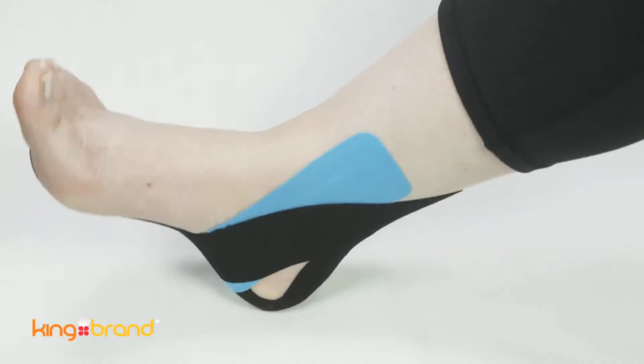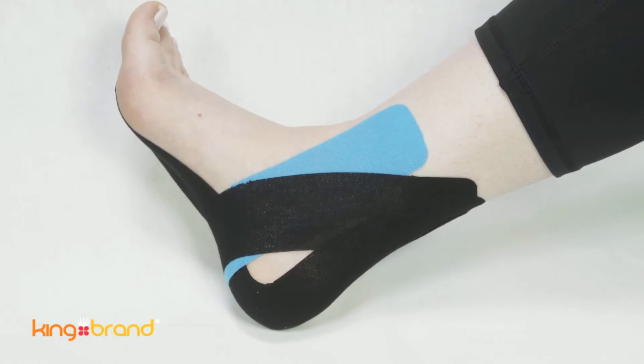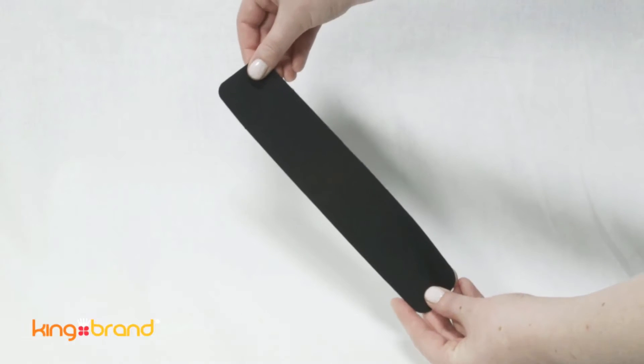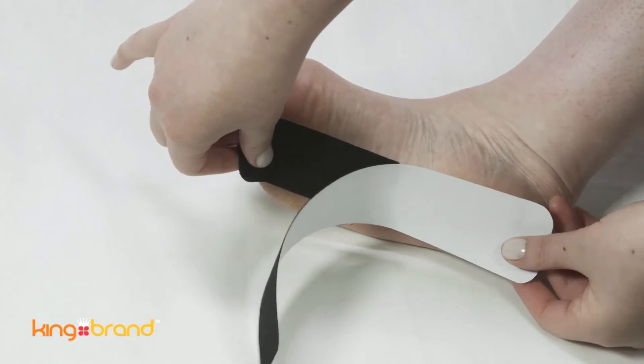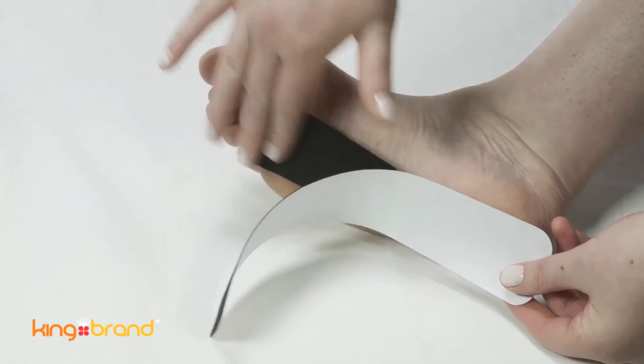For application to the foot for the treatment of plantar fasciitis, start with one piece of 10-inch support tape. Place the tape by anchoring it at the bottom of the ball of your foot, the area right below your toes.